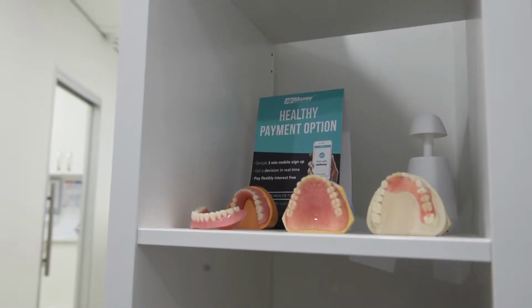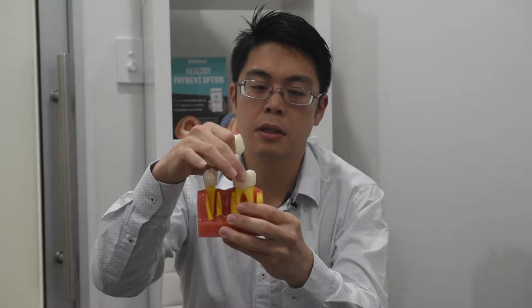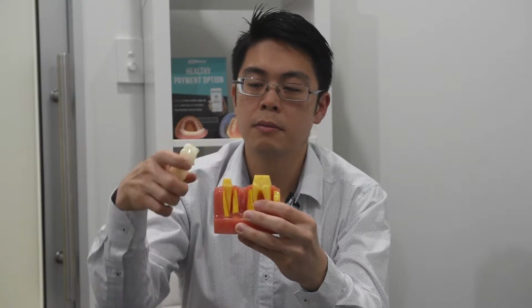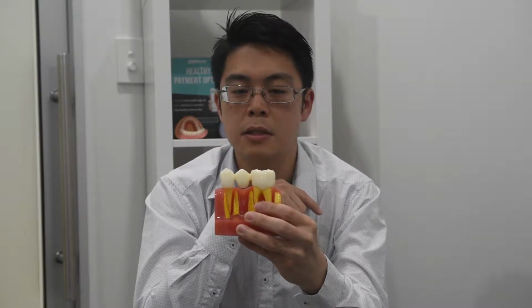The other option is the bridge. The bridge is a fixed option, like an implant. It stays in the mouth, you don't actually take it out. A bridge, however, requires you to adjust the 2 teeth next to it. So this is an example where, to put a bridge on, you have to adjust the 2 teeth next to it so that it becomes like a funnel, so that you can force your bridge on top of it, and this bridge attaches to the missing tooth.